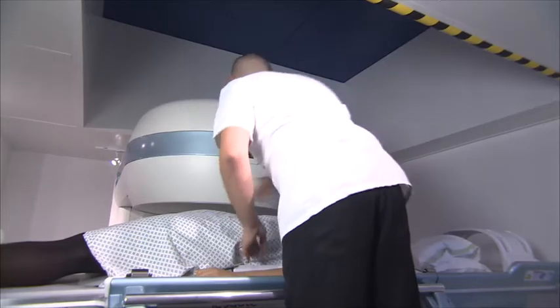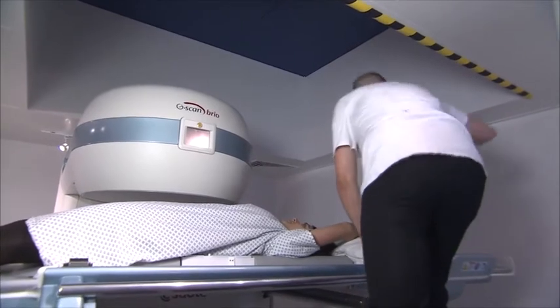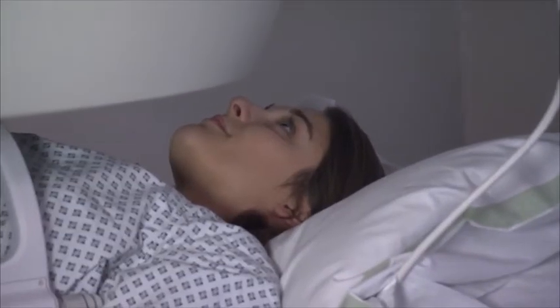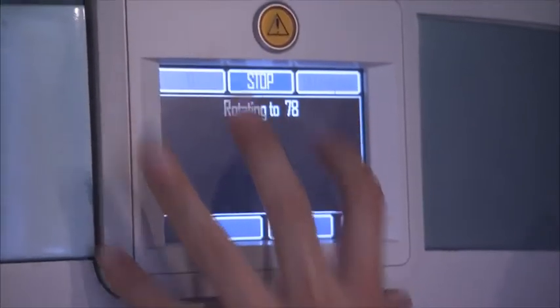When our patients arrive, we pop them onto the table while they're lying flat so we can get them in the right position. We position them onto the scanner, which has a small computer screen on the side that lets us visualise the actual position of the patient relative to the magnet.